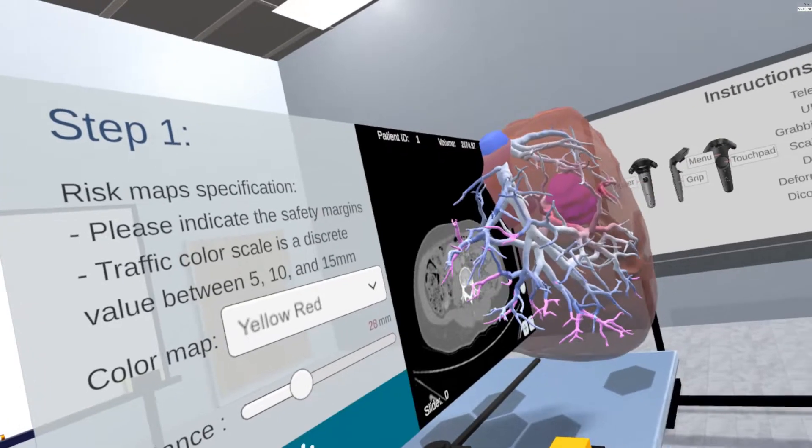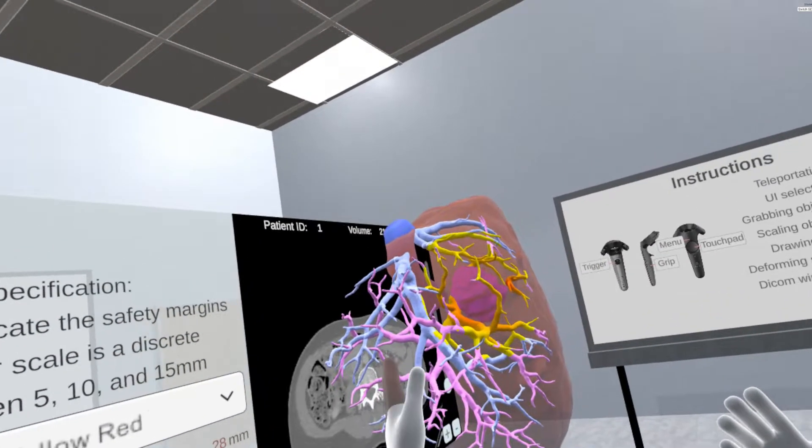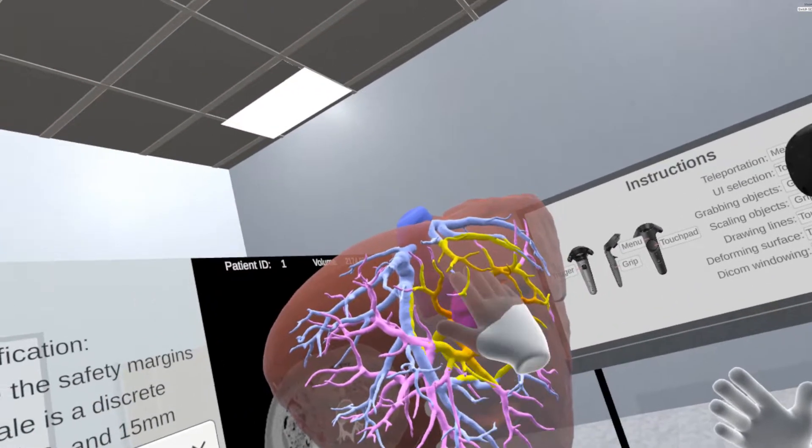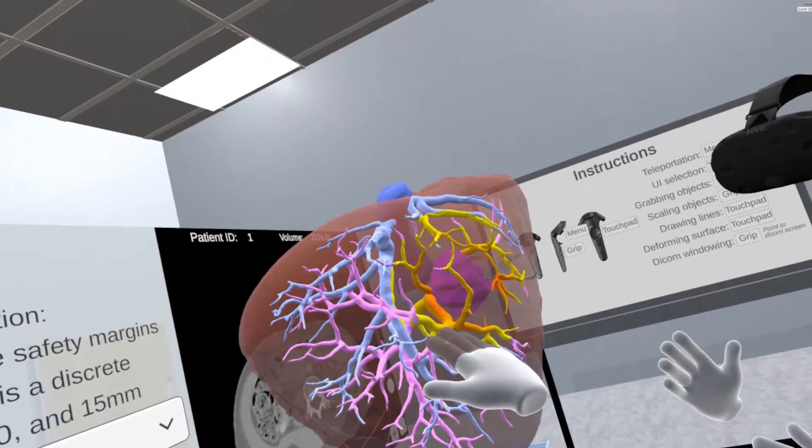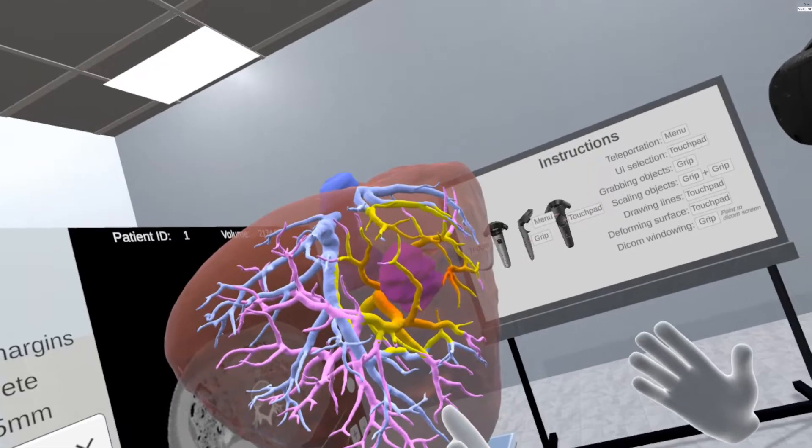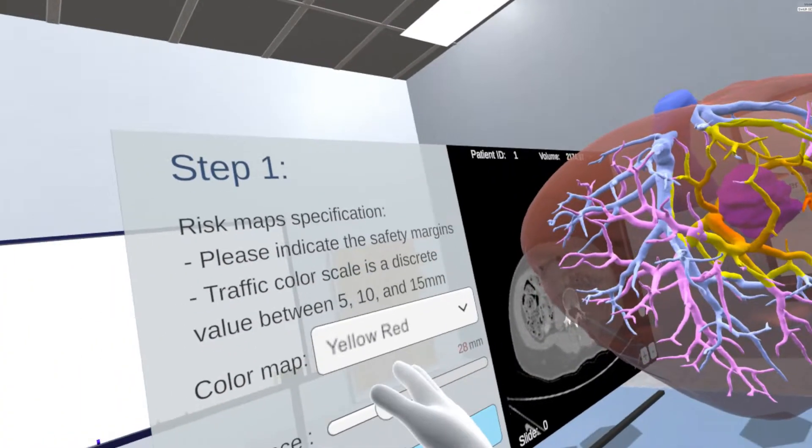Based on this visualization, the surgeons can evaluate the affected vessel systems and understand the potential resection. As default, we employ the risk maps visualization with a distance of 5, 10, and 15 mm around the tumors.